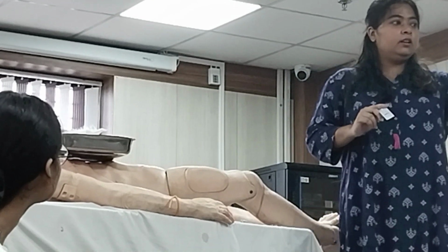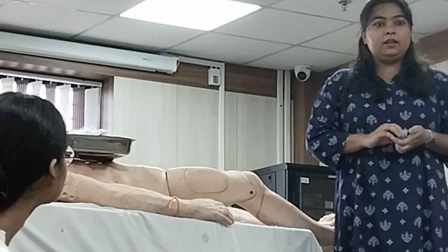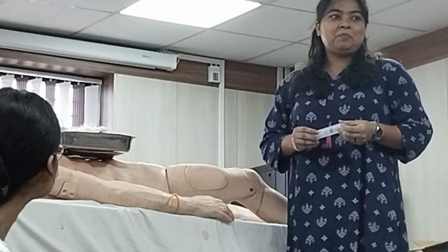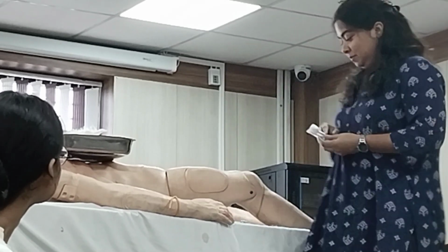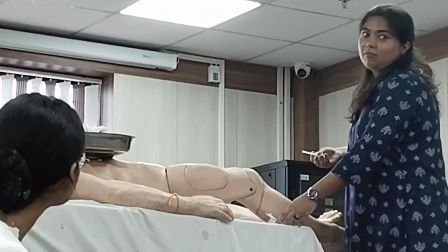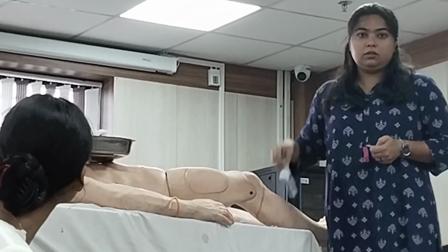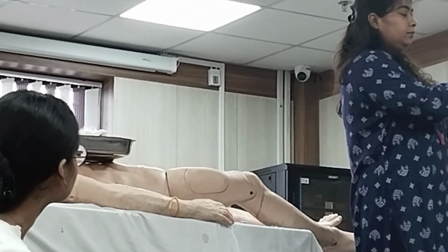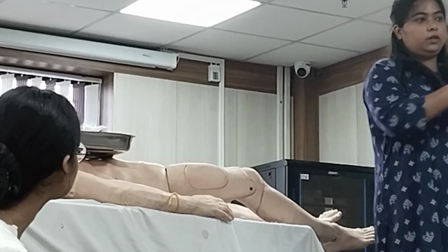In the medicine ward, you may be spared, but in the pediatric ward, if the tourniquet is left there, then you will be meeting a very young patient with gangrene. Why? Because the tourniquet will not allow arterial blood flow also. So ultimately, the patient will end up with gangrene. So remember to open the tourniquet before you go away from the patient.